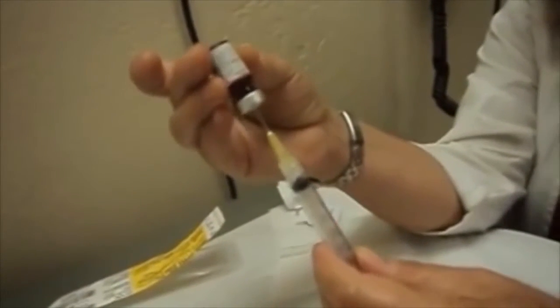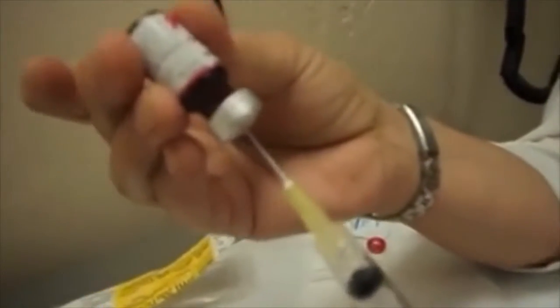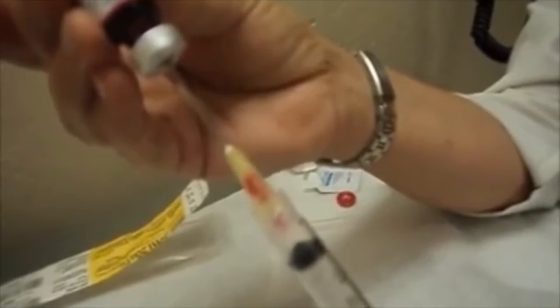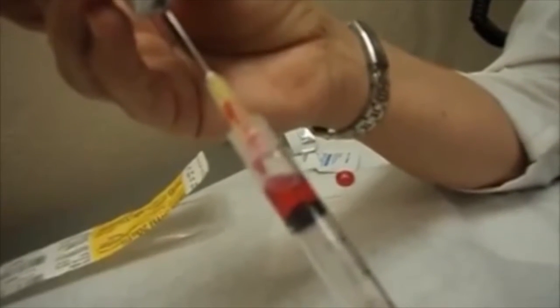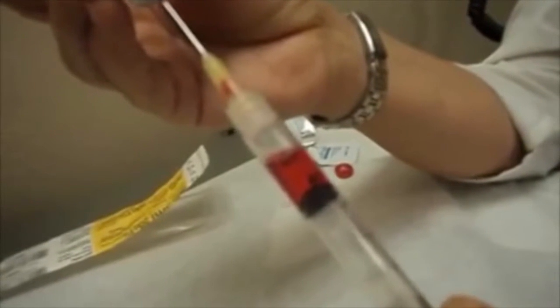The harder part comes when you put this upside down to draw out the medication. And in the small 1-dose vials, you need to be very careful to withdraw the needle till you can see it at the bottom of the vial. This assures that you are under the medication. You're going to pull back the syringe, and the liquid should flow into the syringe without much resistance.